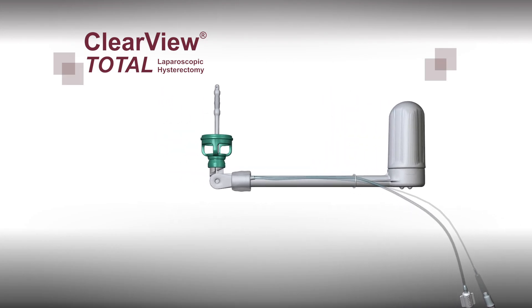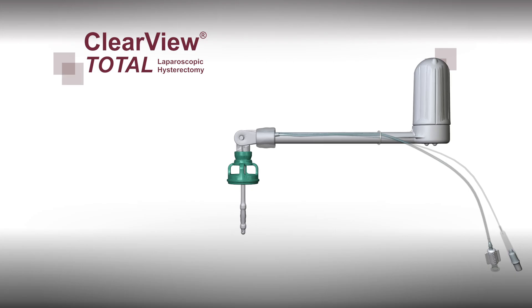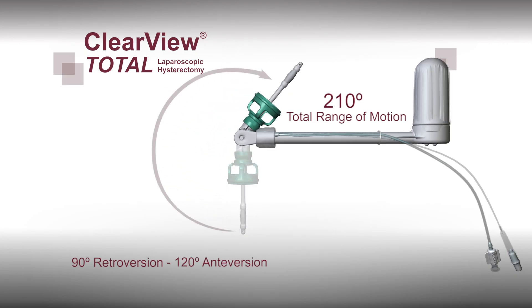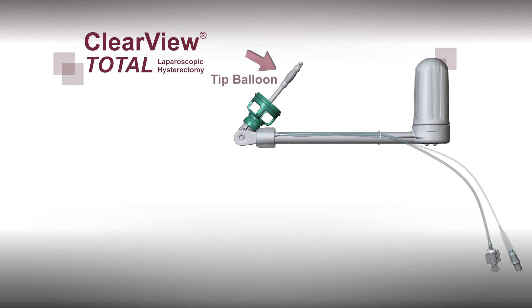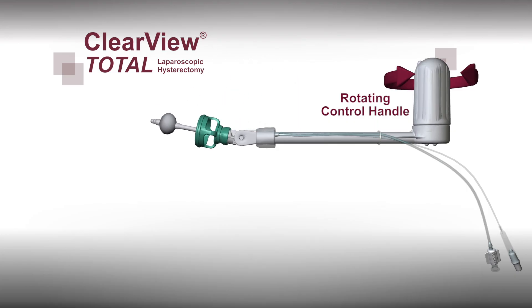Clearview Total offers the same great benefits as the traditional Clearview: the greatest range of motion, allowing 90 degrees retroversion to 120 degrees anteversion, the tip balloon which helps anchor the device inside the uterus, and the rotating control handle which facilitates one-handed manipulation.